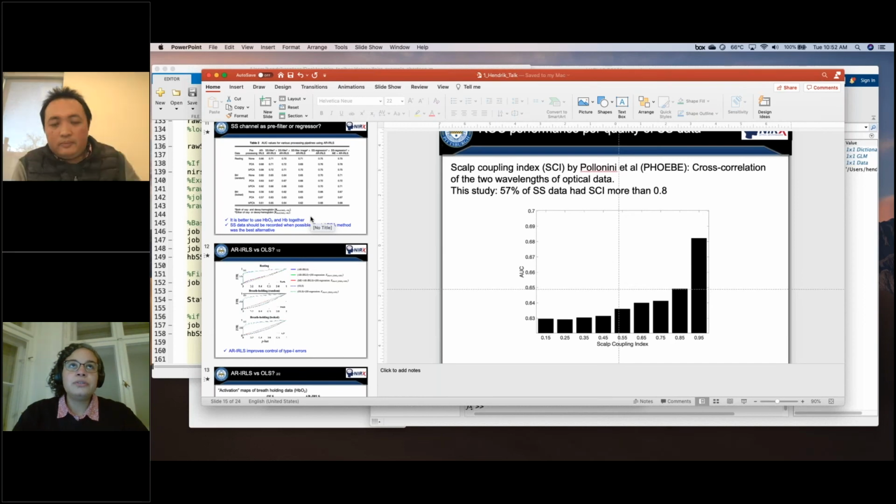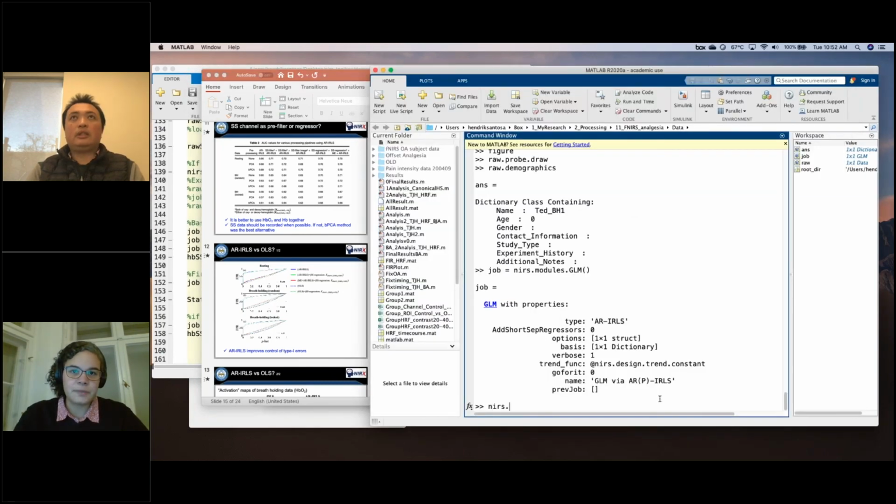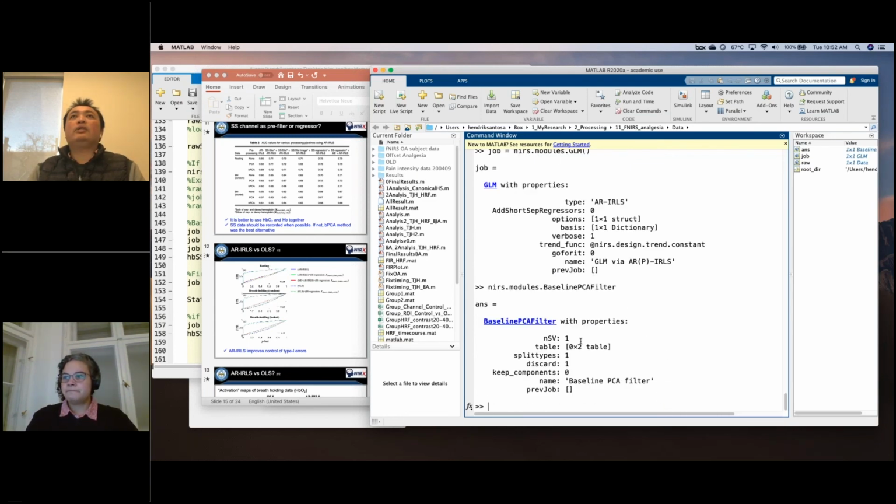Gotcha. So you don't really set the number of regressed components, but rather the percentage they can explain of the data. Okay, that's very interesting. So if you use baseline PCA using the toolbox, you can put one component, 5 components, or you can put 0.8. Okay, yeah, you can put 0.8.